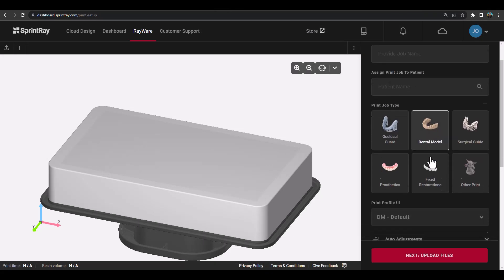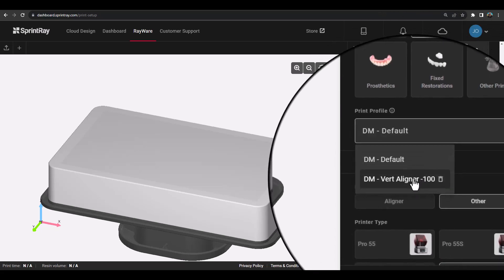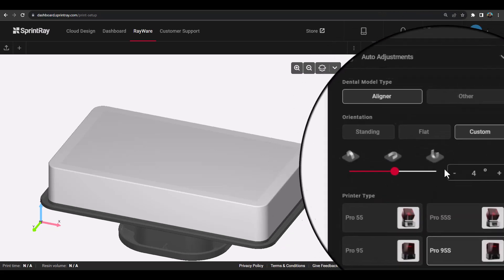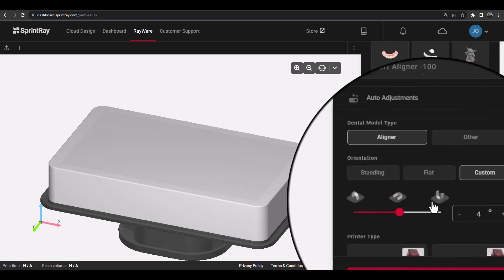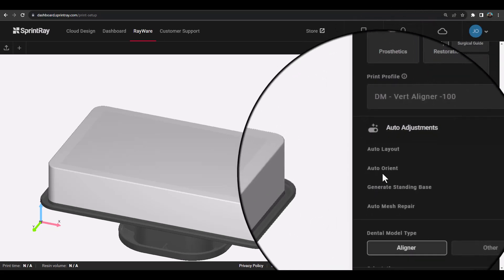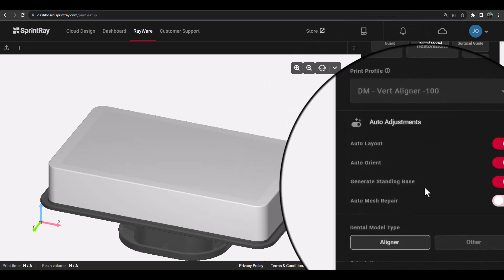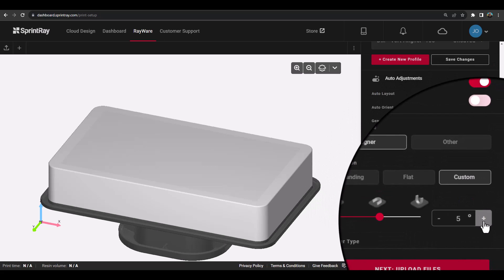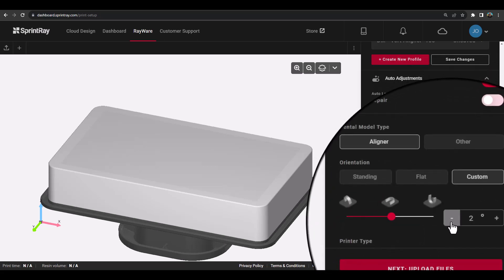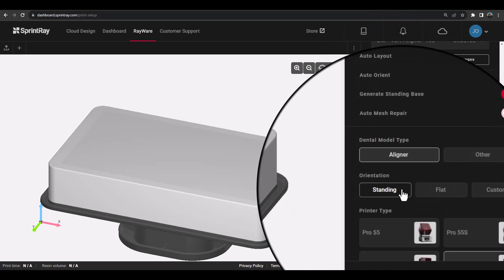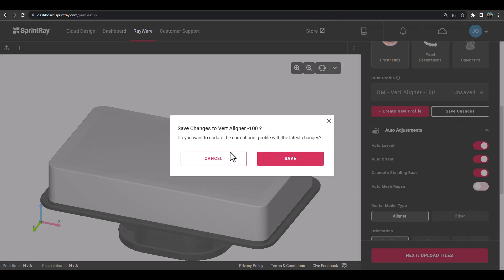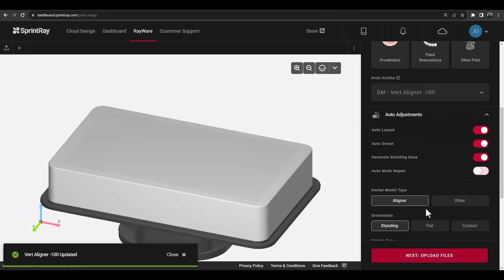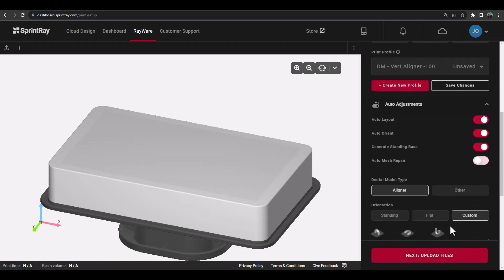You can also create custom print profiles. Whenever the default profile is modified, you will have the ability to save a new print profile or save the changes to an existing print profile that you have already saved previously. Once modifications have been made, you can create a new profile or save changes under the print profile list. Any future print jobs with this model type selection will have those custom print profiles available from the drop-down list.